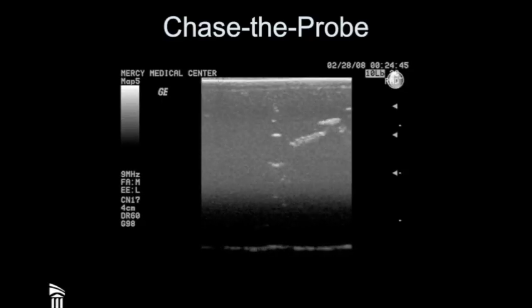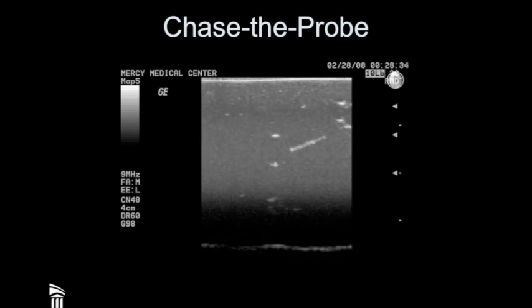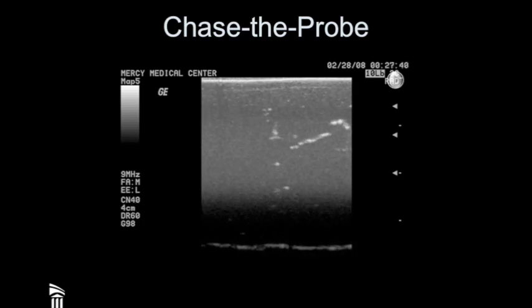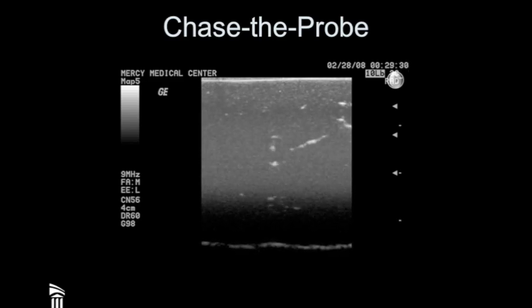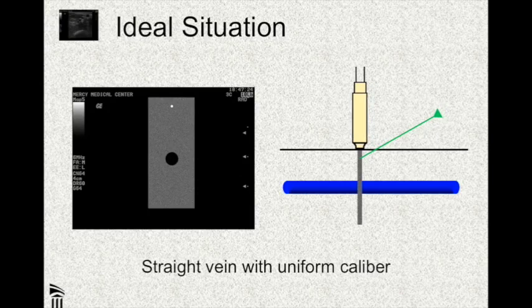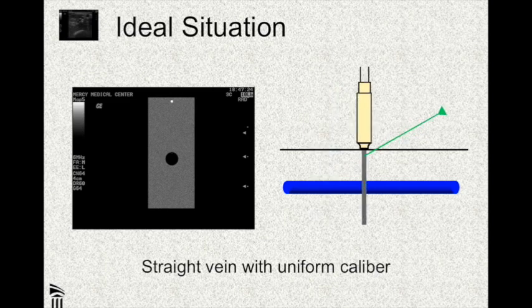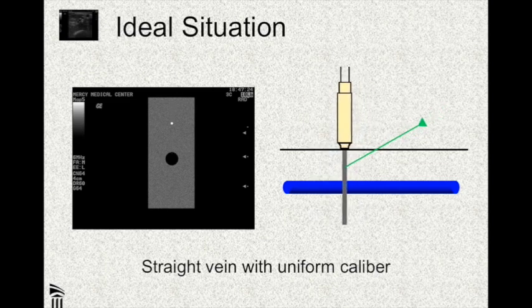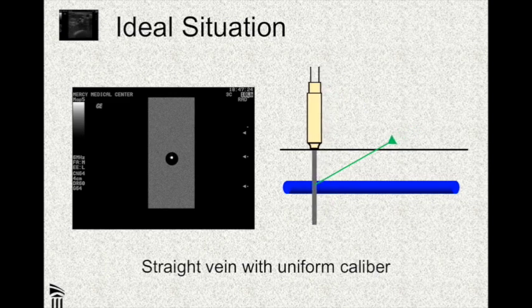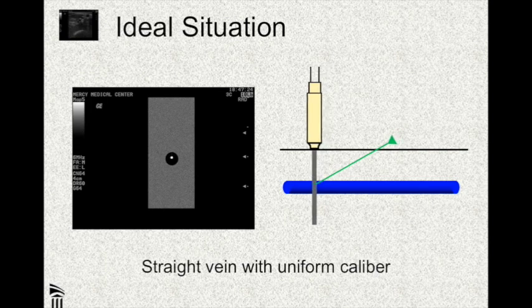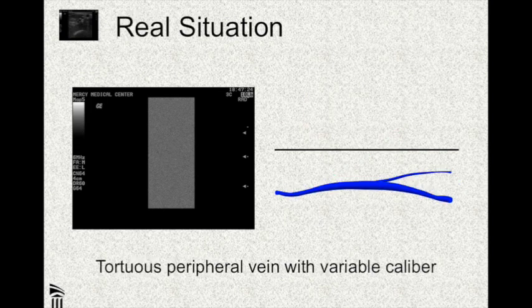This is what chase the probe looks like in the gel model — you can see the needle appear and disappear stepwise as it gets closer and closer to the blood vessel. Once you get good at this, you can move them almost continuously and make it look nice and smooth. This is with an idealized blood vessel. Unfortunately, a lot of blood vessels are not straight with uniform caliber — they're more ugly looking like this.